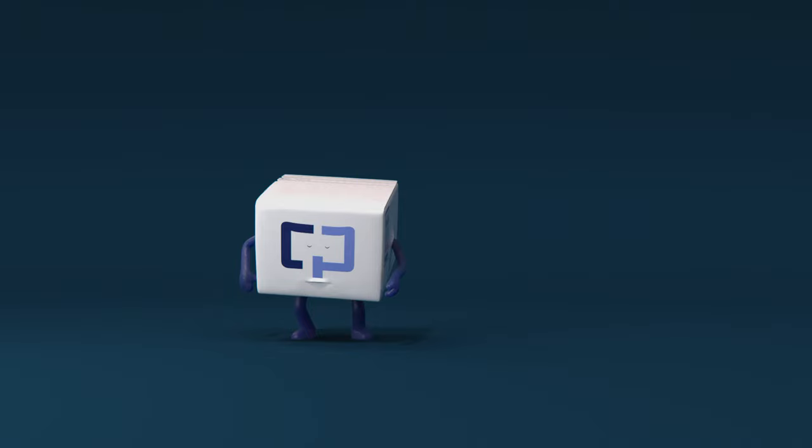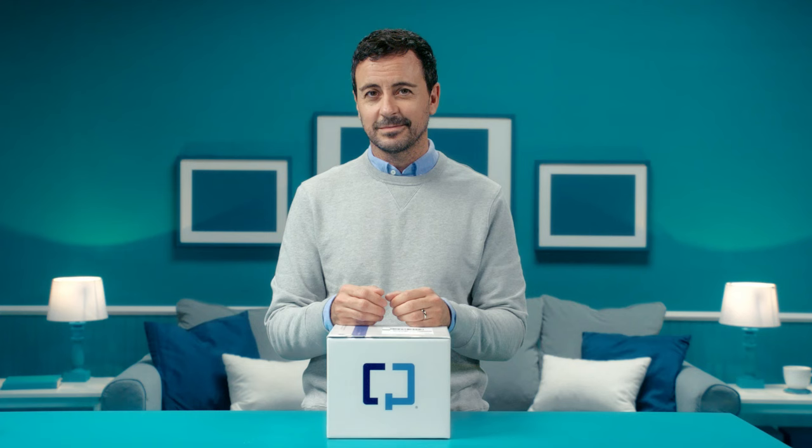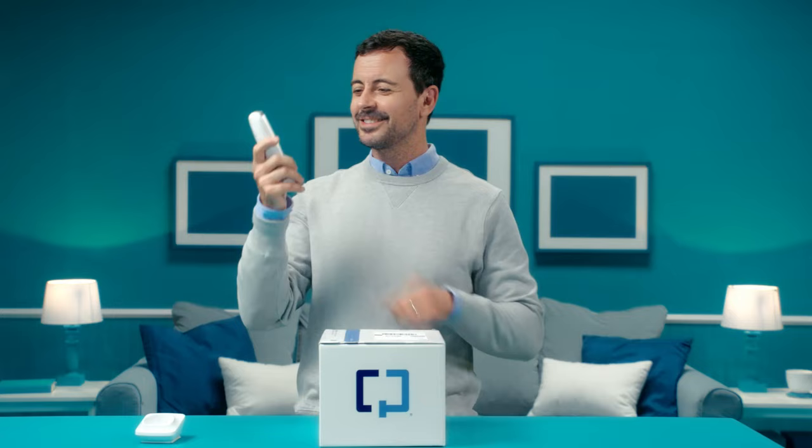Your health care provider has ordered Cologuard for you and you've received the collection kit. That may sound complicated, but we're going to make it easy. Cologuard has no special prep or changes to diet or medication — neat, right? We'll show you in a few simple steps how to collect your sample and ship it to the lab where it will be tested. You may receive a few phone calls from Exact Sciences Laboratories to remind you to use Cologuard if you haven't already.